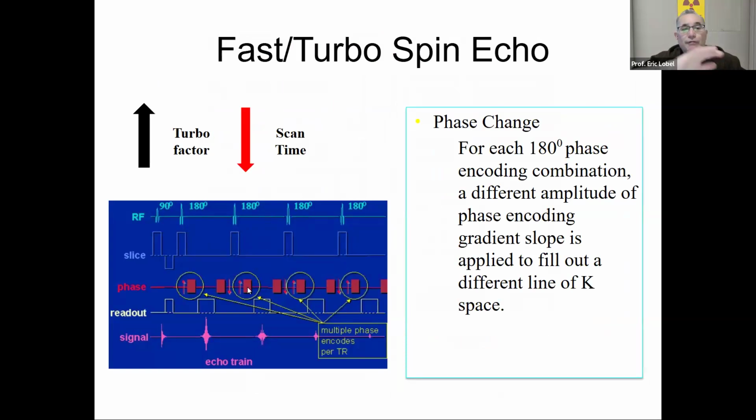Phase encoding means our phase lines. The readouts, those are the same. Usually the bandwidth does not change in the middle of a sequence, right? So this particular gradient is going to have an easy day. The phase encoding is going to go crazy, and the slice is going to change depending on the slice, but the readout is going to be the only one that's consistent. Remember, this is also known as the frequency encoding gradient, and they're still centered. Now, I mostly don't like this illustration, except for one thing.